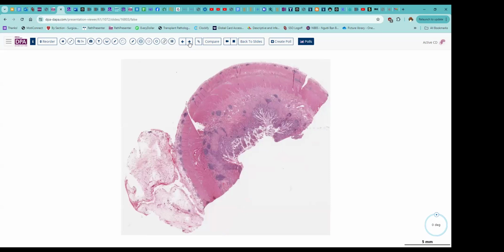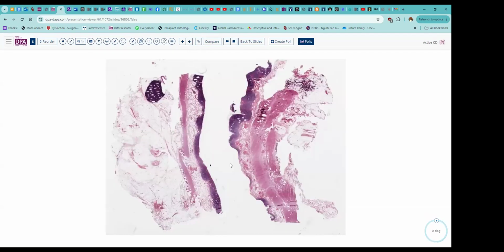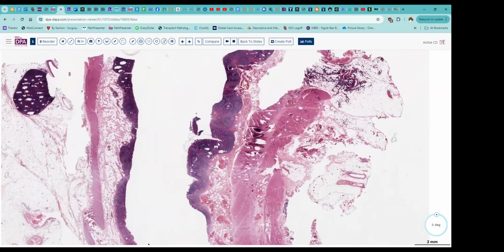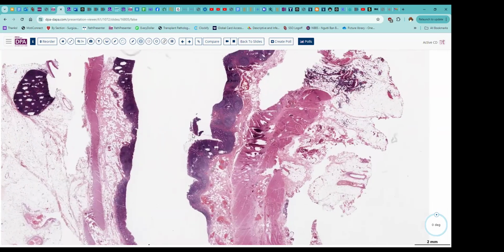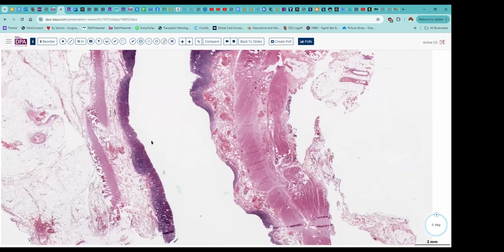Let's go on to the next case here. We didn't see any granulomas in that particular sample. Here's another setting that's been termed Crohn's disease, but here we can see very little in the way of deep involvement. And it looks a lot like that ulcerative colitis case. We don't see much in the way of deep inflammation.